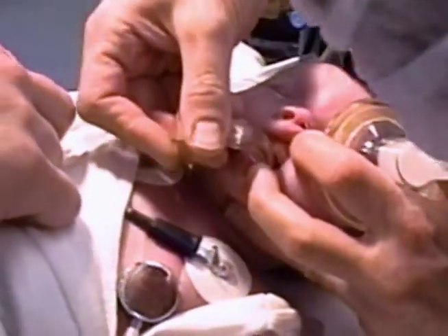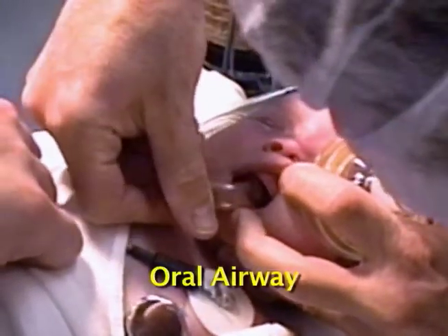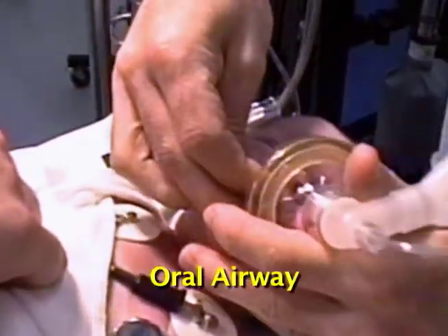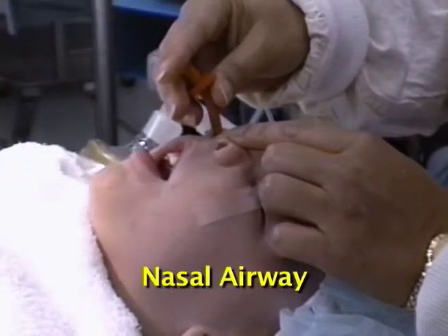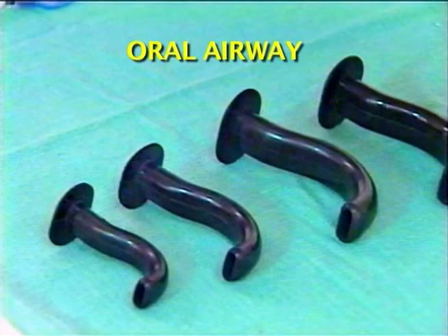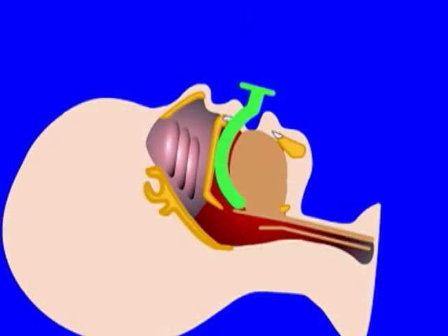If obstruction persists, the next step is to insert an oral airway or a nasal airway. An oral airway is a fairly firm curved piece of plastic which sits on top of the tongue and pulls it and the associated soft tissue forward, away from the top of the larynx. The correct size puts the flange outside the teeth and gum line and positions the tip near the vallecula.